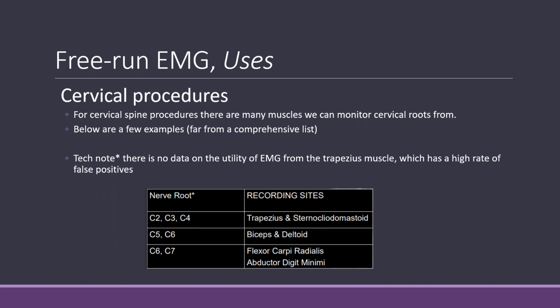Just a little note also, there is no data on the utility of EMG from trapezius muscles. They also have a high rate of false positives. So they may be monitored, but the usefulness of trapezius EMG is in question.